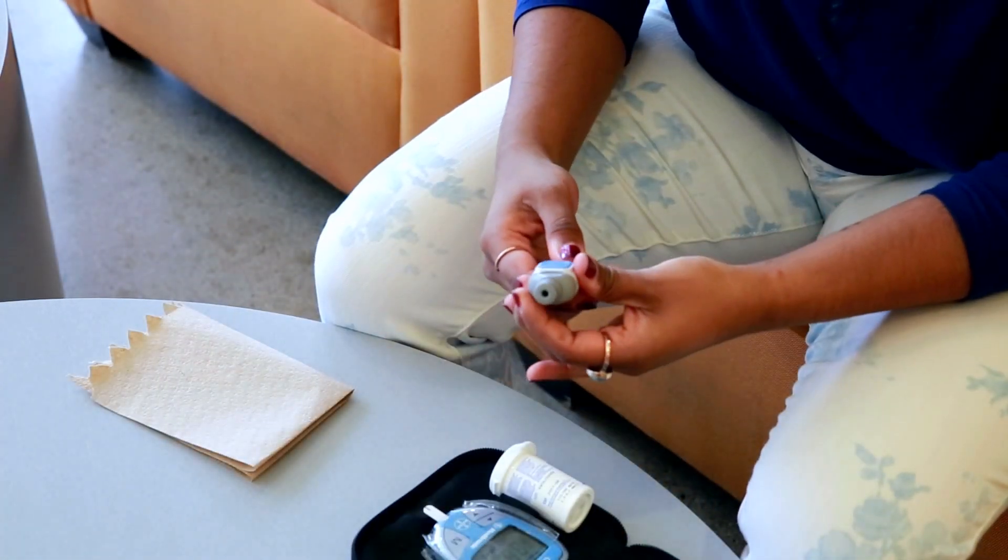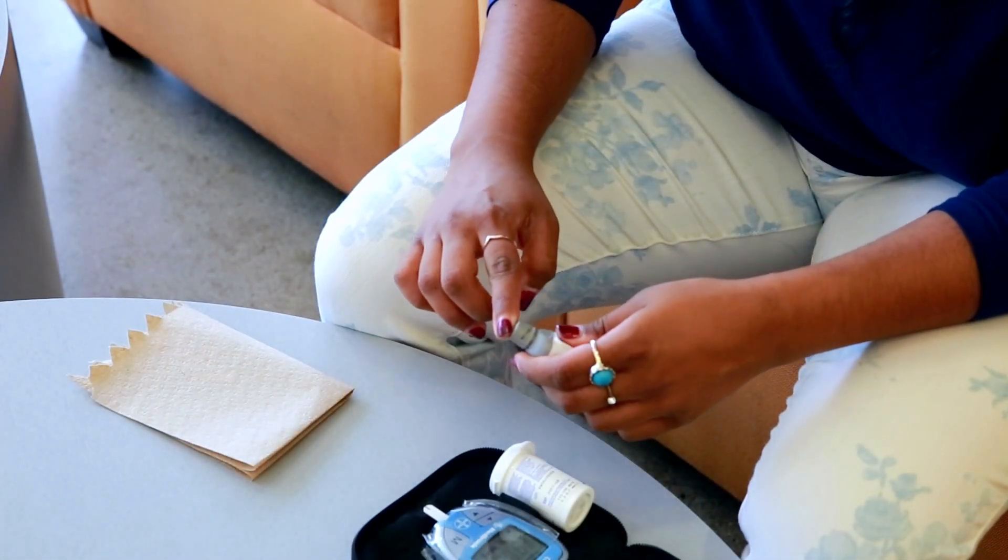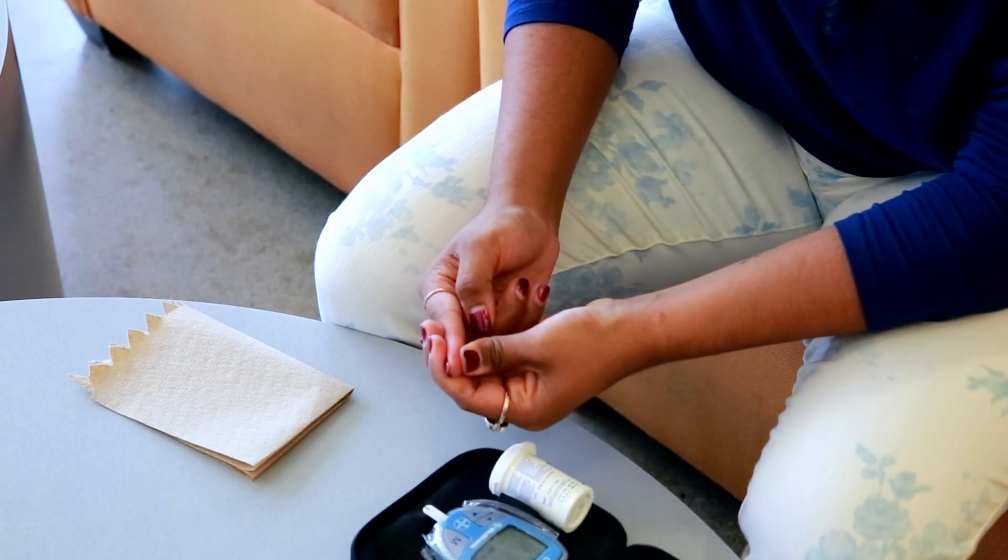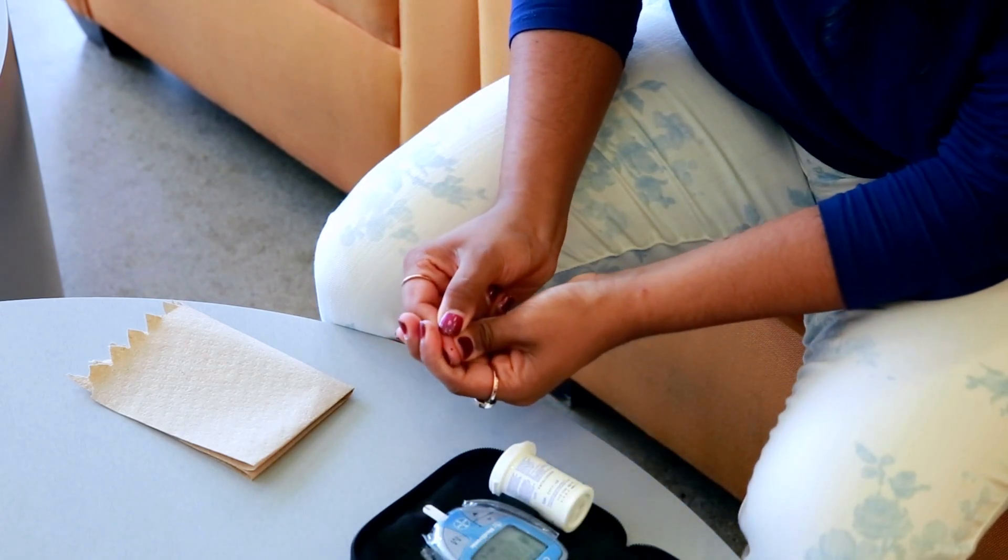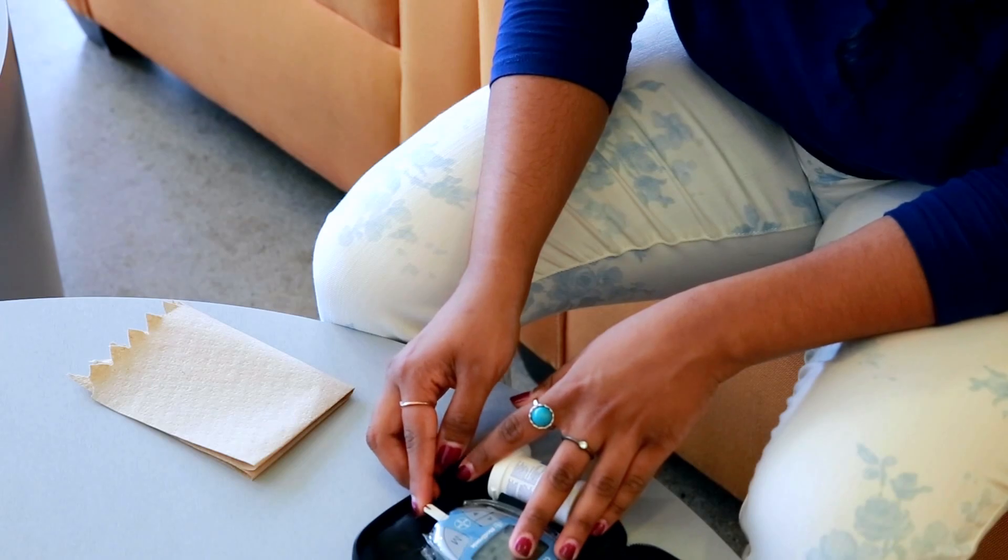Diabetes management is key to ensuring high quality of life, but current methods consisting of finger pricking are crude, inconvenient, and painful.